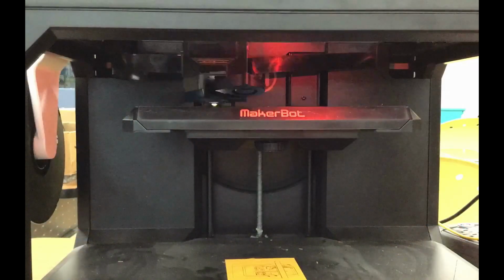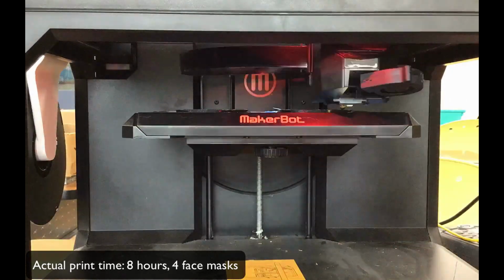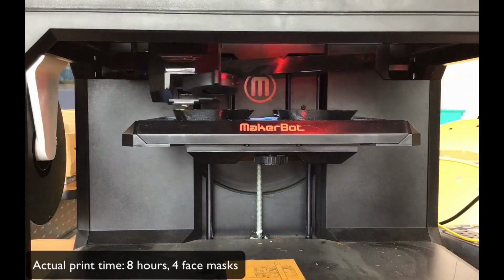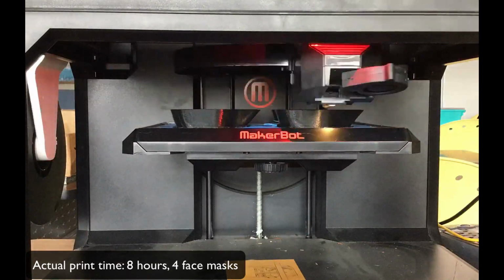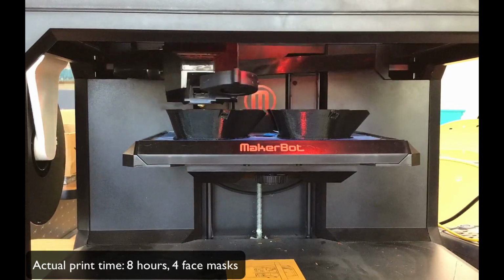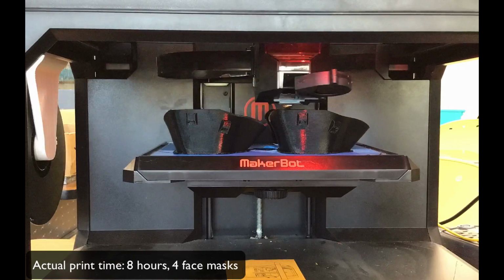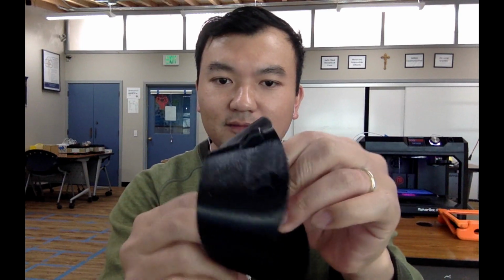Here's another time lapse. Okay, so after my second print, I've been successful. So here's what it looks like. I changed the filament color also. It's pretty sturdy right now, so that's a good thing. The next step that we're going to be doing is installing the connector and the cap and adding filter onto it.